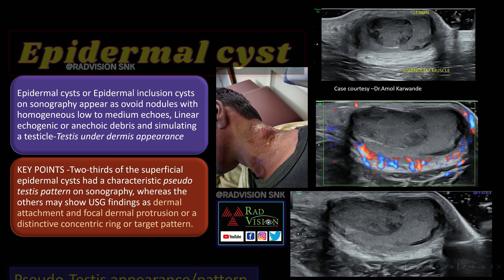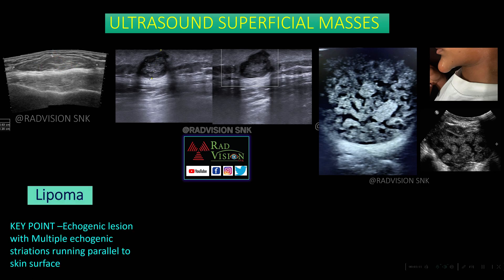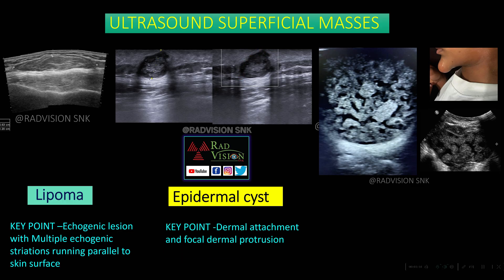Here you can see an echogenic lesion in the subcutaneous tissues with multiple parallel echogenic striations running parallel to the skin surface — this is a case of lipoma. In the adjacent image, there is a well-defined hypoechoic lesion with focal protrusion towards the dermis. Whenever you see a focal dermal protrusion or dermal attachment, one of the common differentials is epidermal inclusion cyst.